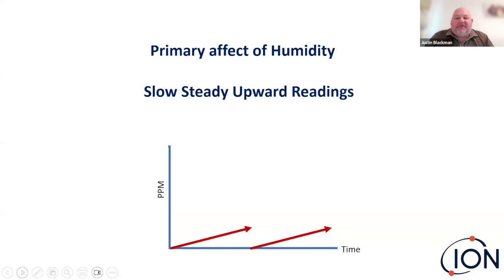They would scrub the electrodes and the lamp inside with methanol and try and get rid of any contamination. And send you the unit back along with a large service bill and tell you it's all good to go. However, you might the next time or the second time or third times afterwards have the same problem again.